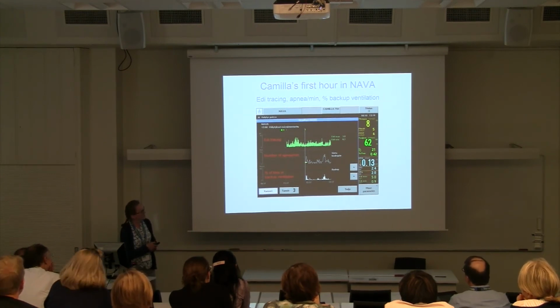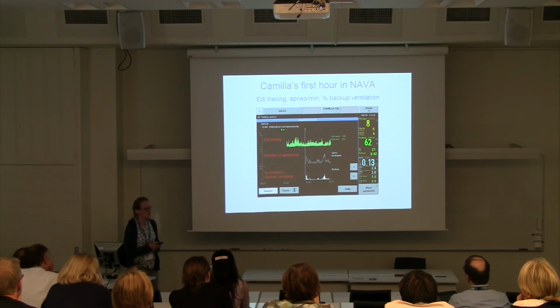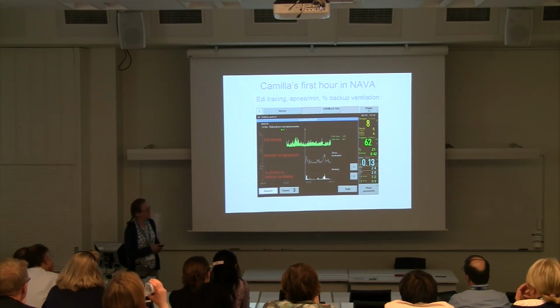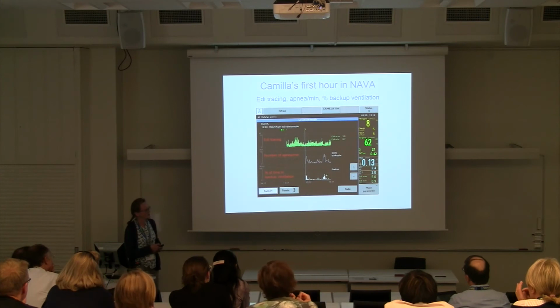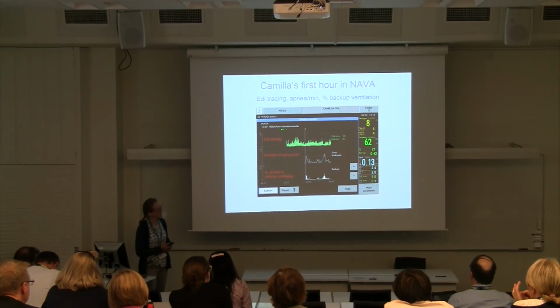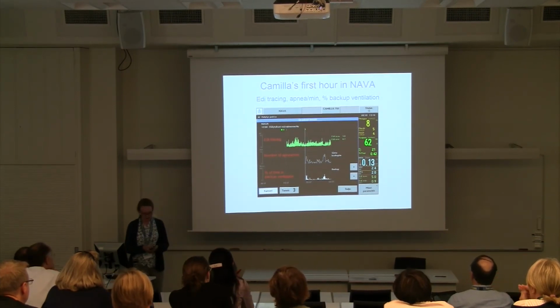So during the first hour with a 2-second apnea time, she was switched from 0 to 8 times per minute to the backup ventilation. But what is important, she didn't get stuck on the backup ventilation, so the percentage of time she was on backup ventilation was quite small.